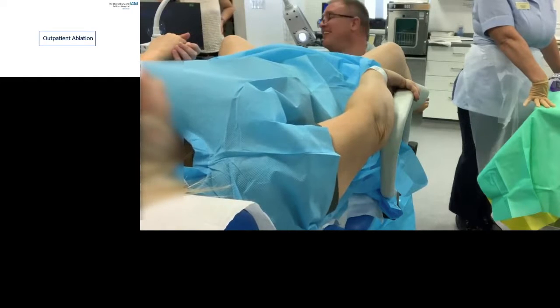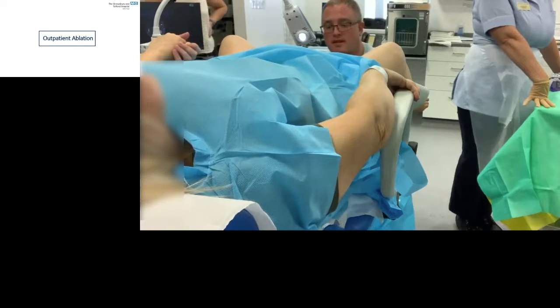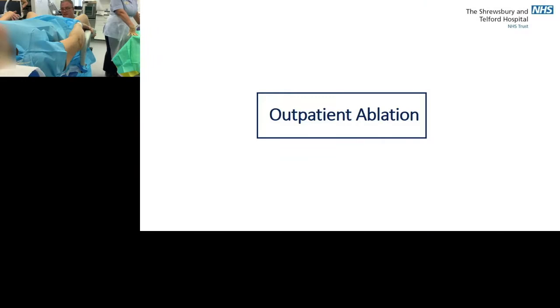One of the questions is, what is the pain score now? So what would your pain score be now? Finished now, by the way. 2? 2? Yeah. Okay, so we've finished. It's 43 seconds.